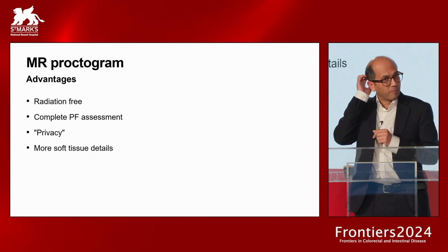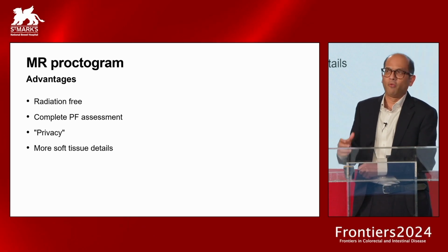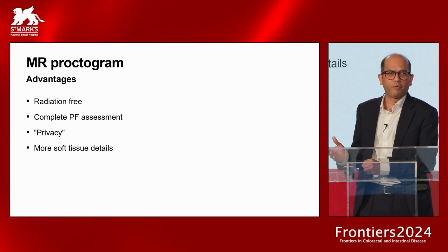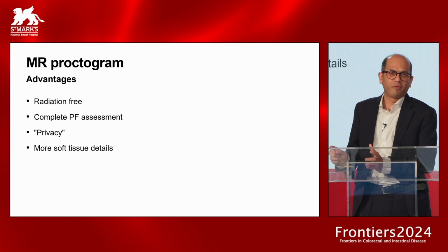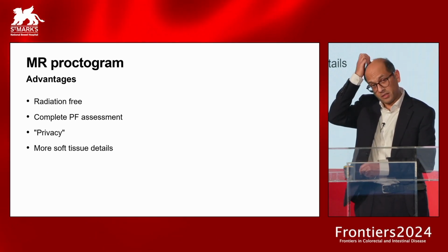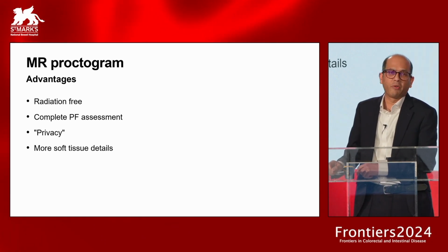So I'm just going to run through the key advantages of the MR proctogram. Obviously one of the major benefits is that this is completely radiation free. You've got that assessment of all of the compartments, so a more thorough pelvic floor assessment. There is the question of privacy; I'll show you shortly a study that shows a different perception from different patient groups.